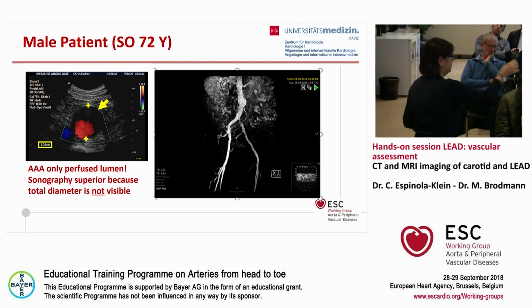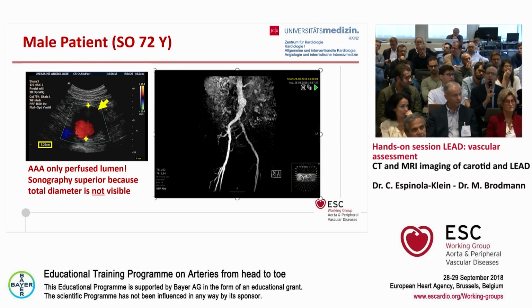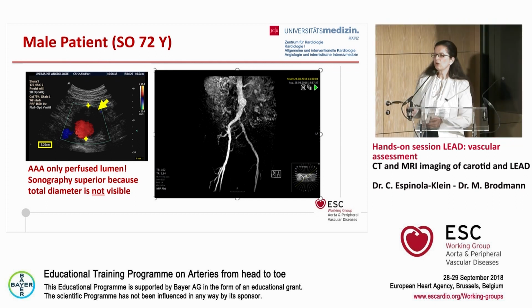And CT scan? For the follow-up of the aneurysm, depending on the treatment, after treatment, or because I see it's 5.2 centimeters, 52 millimeters. So for the follow-up, depending on surgery or endovascular prosthetic, right? I think, oh, Victor. It's in line with what Tristan says, because we have three kinds of follow-up.